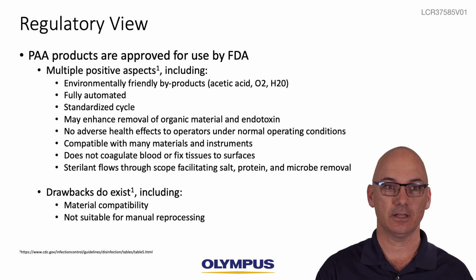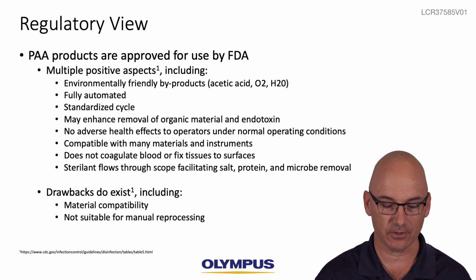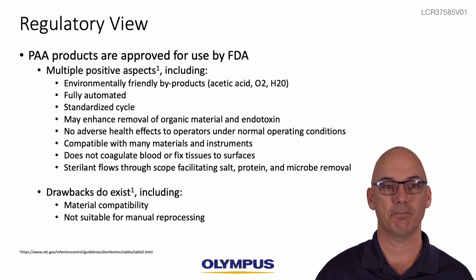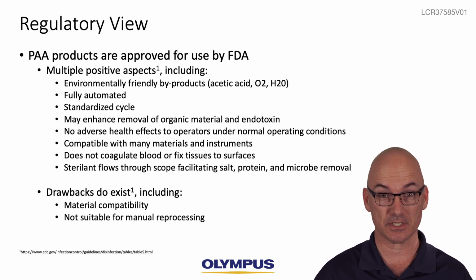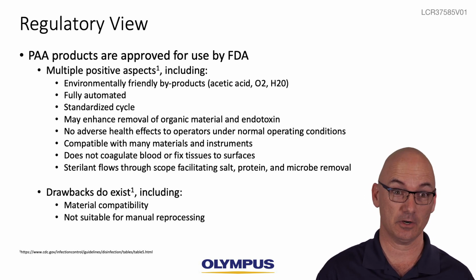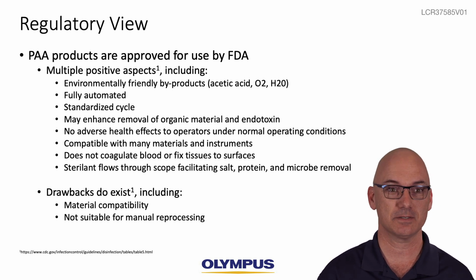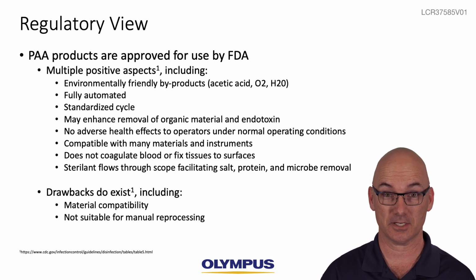It may enhance the removal of organic material and endotoxins. It has no adverse health effects to operators under normal operating conditions. It's compatible with many materials and instruments. It does not coagulate blood or fix tissues to surfaces when used. And it's a sterilant that flows through scopes, facilitating salt, protein, and microbe removal. Drawbacks do exist, so nothing's perfect, but it may not be materially compatible with all products, and it is not suitable for manual reprocessing. It should only be used in an automated reprocessor.